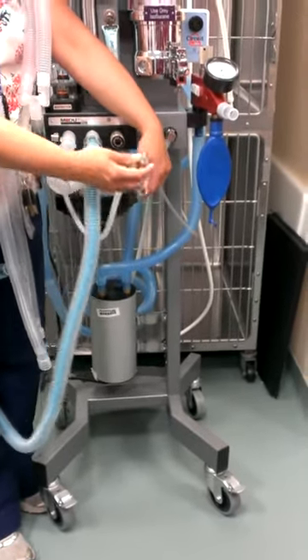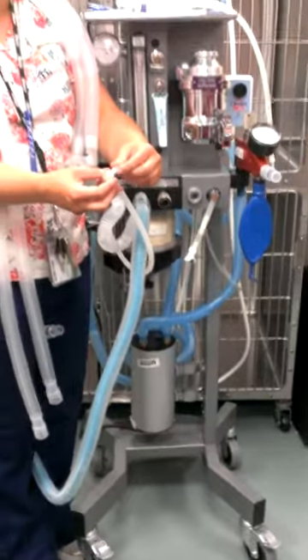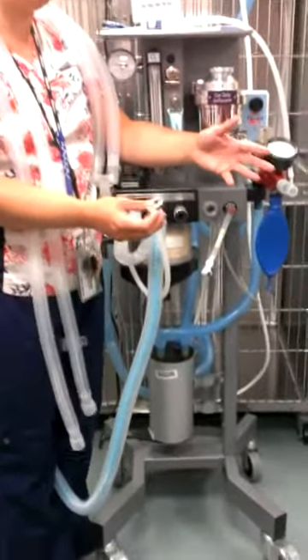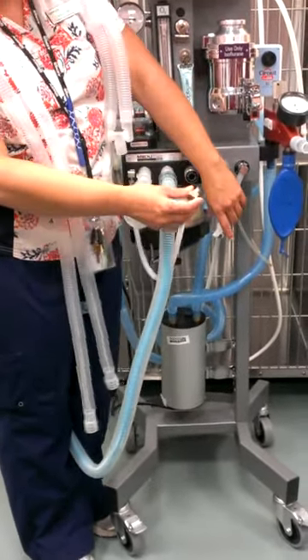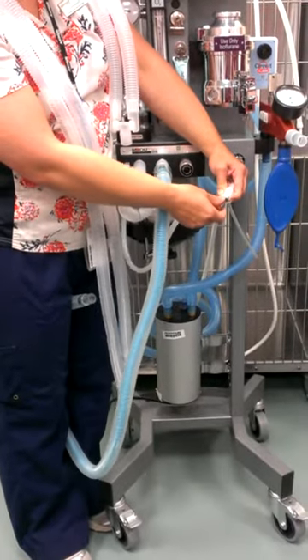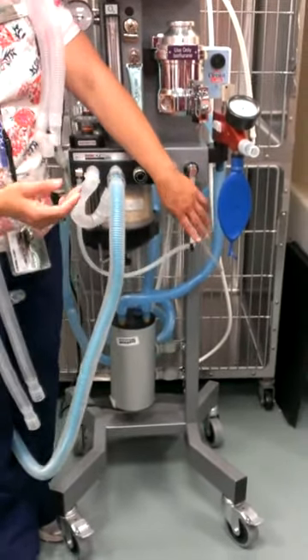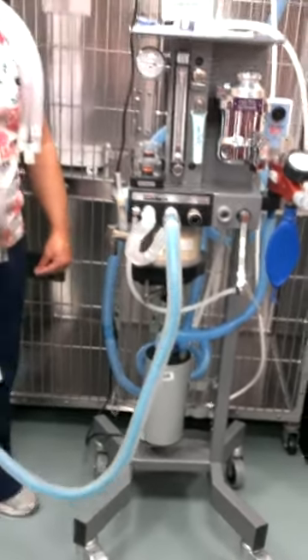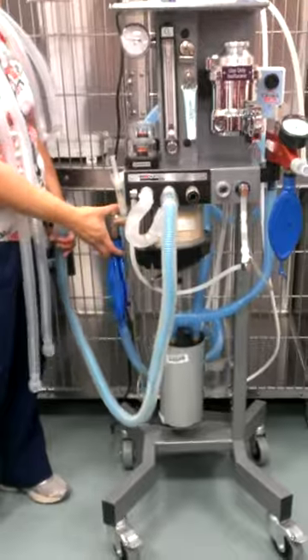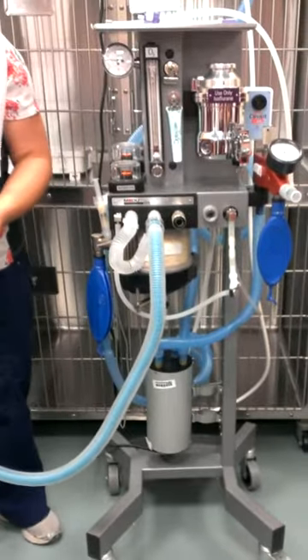Because these machines are used so much with students taking them apart and putting them back together, we go through these O-rings like crazy. It's not a bad idea to just push the button so there's not as much force against it, and then give it a little pull so you don't actually hear the click. Now my oxygen's hooked up. Am I ready to do my leak test? No — you need your reservoir bag. I've got that on there.